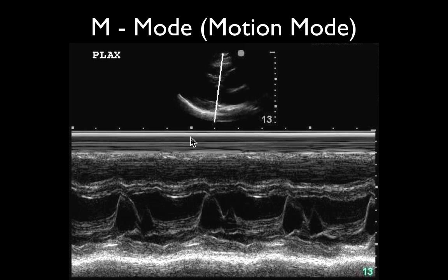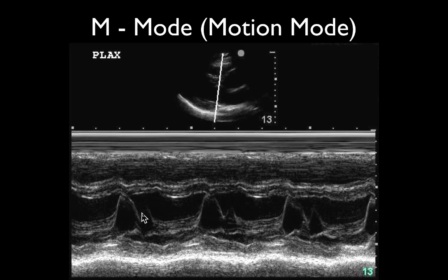These bright still lines correlate with the structures in the anterior chest. We see a little bit of haziness — a hypoechoic, anechoic region — and that's going to be this right ventricular outflow tract. Then this thick structure is going to be our septal wall. Then we notice we have an anechoic region with something moving within it, and that's going to be our mitral valve leaflet. We can see how close that comes to the septal wall.